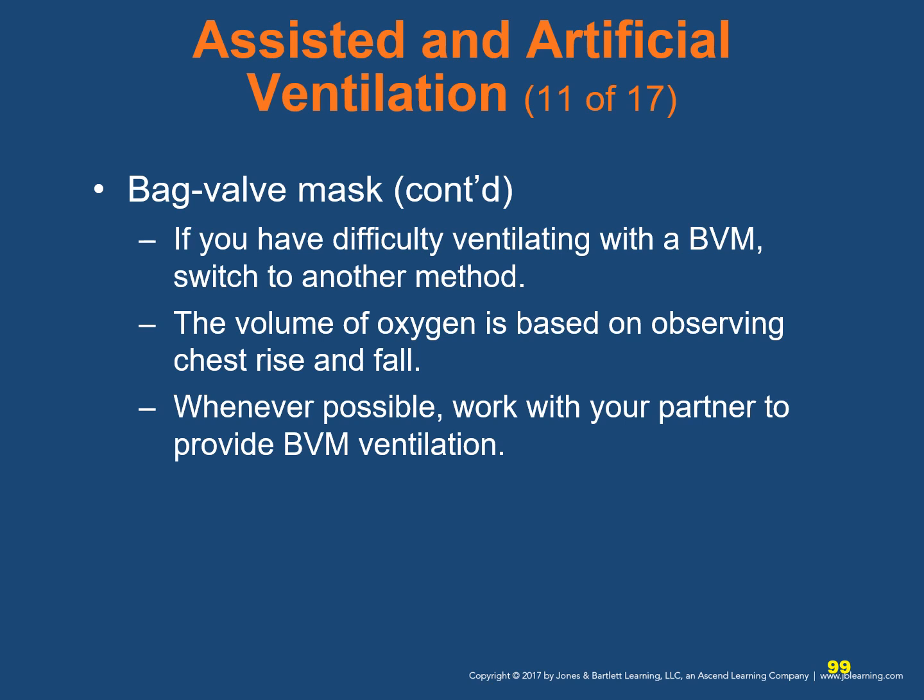For a cervical spine injury, stabilize the patient's head and neck and use the jaw thrust maneuver. You can use your knees to stabilize the head. Open the patient's mouth. Suction is needed. Insert an oral or nasal airway to maintain airway patency. Place the mask on the patient's face.